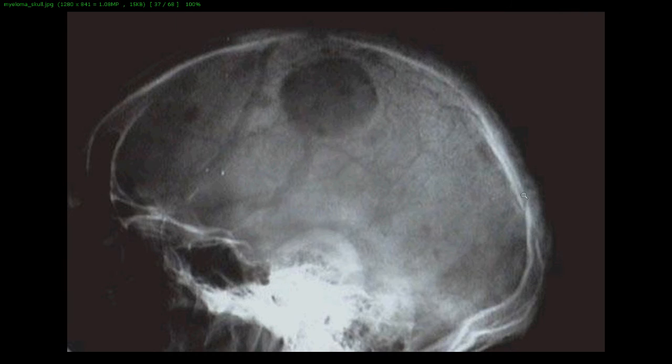These findings in a relatively young black male are consistent with multiple myeloma as a diagnosis. In retrospect, when one sees the very large lesion here, we're taken by that lesion, but there is suggestion that there may be some smaller areas of lucency located within the skull as well, although they're not as completely well defined as the large one.